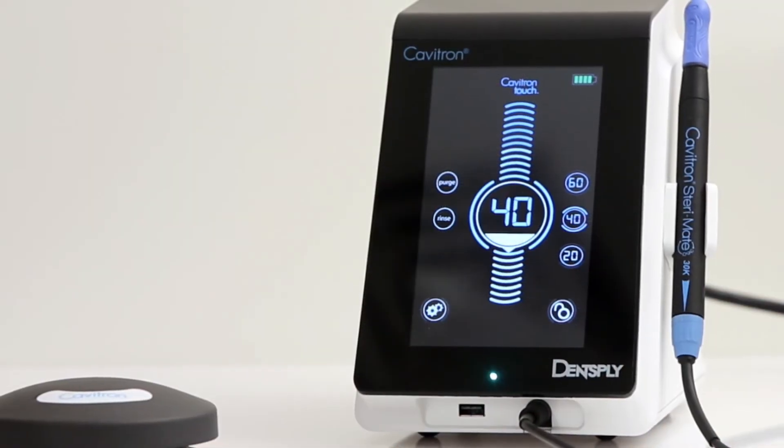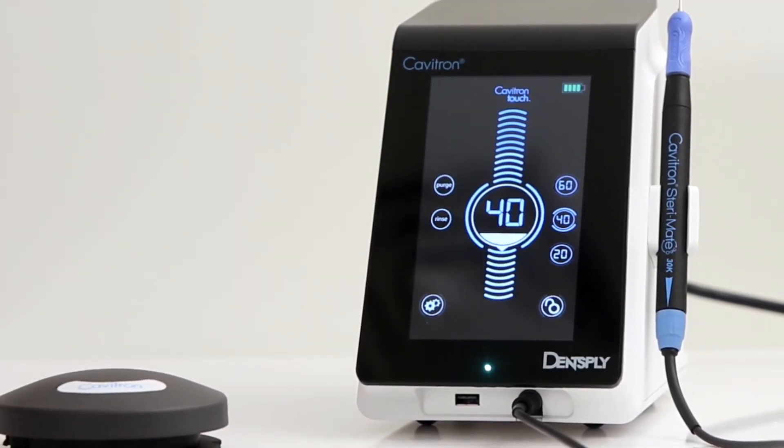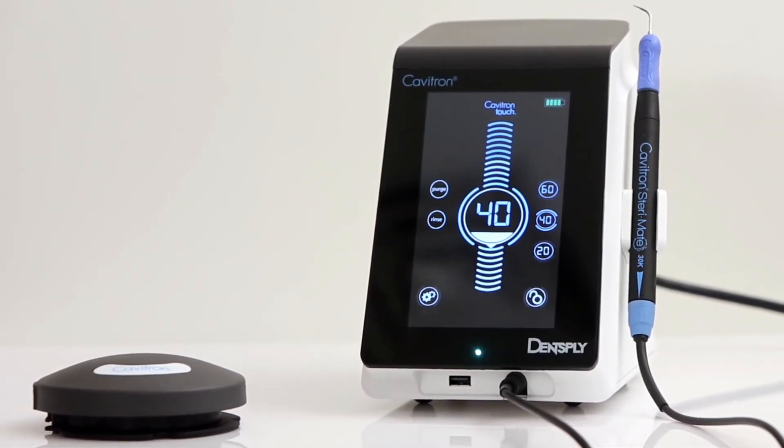Allow the foot pedal to charge up to 4 hours to achieve a full battery charge, which will be visible by the battery charging icon that appears on the screen. The unit will operate with the foot pedal while the battery is charging.